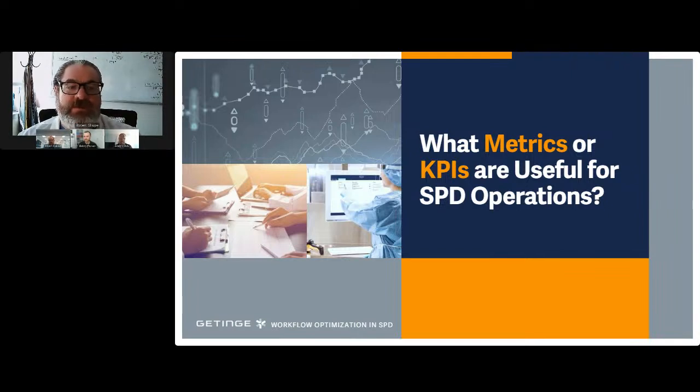Three times a day, we send out a report that says how much work is not sterile, still sitting in our queue. And then we link that back to the case counts. We're not trying to get to 0 every day. We're trying to make sure everything that's needed for the next day is ready and the emergency items are ready, and balancing that in a way that we don't go over a threshold that we know puts us far behind our ability to recover. Yeah, and that stress factor.